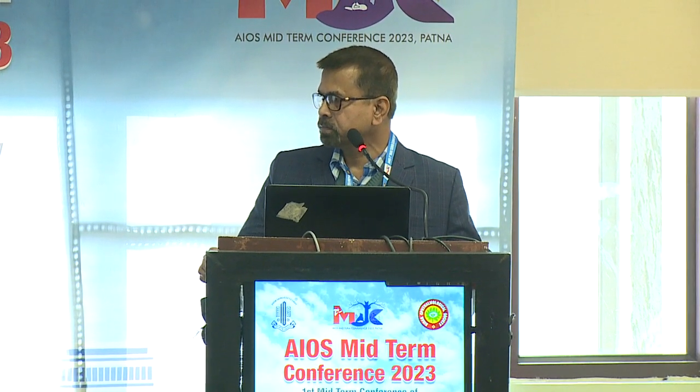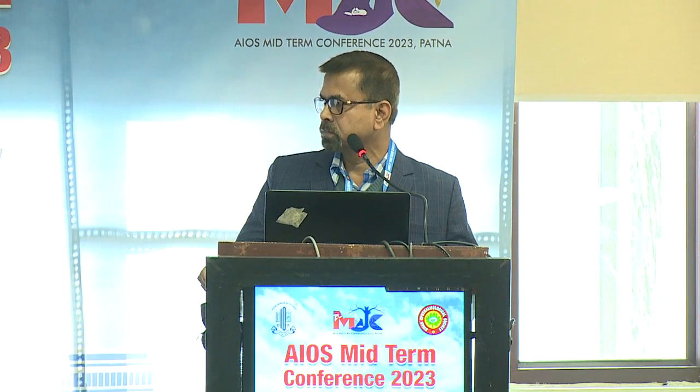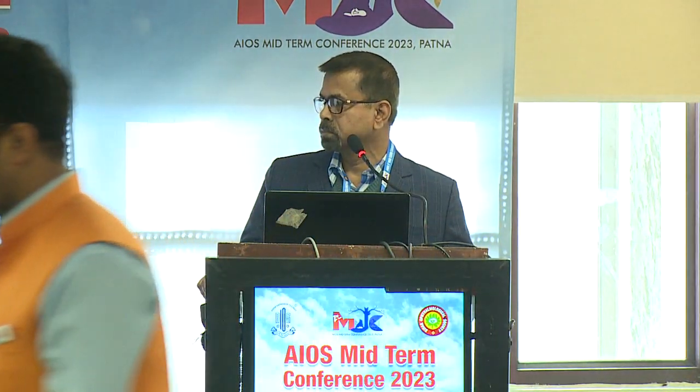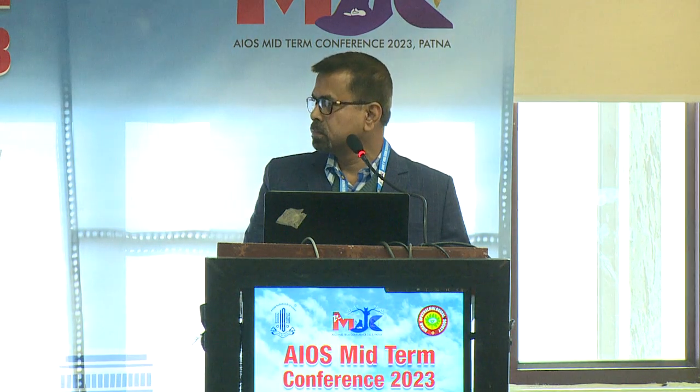So the point taken is to have a slightly larger rhexis because you don't want to have any pull on the zonules, and also it gives you more space. And second thing is staining the capsule is very important because then it gives you visibility throughout the surgery.